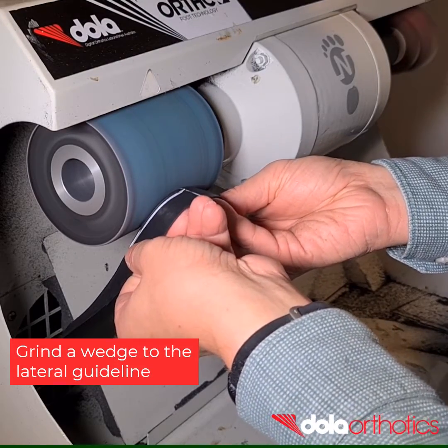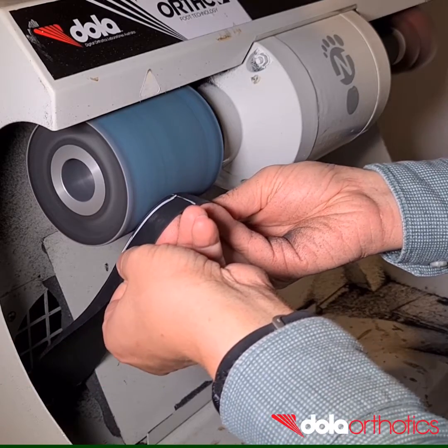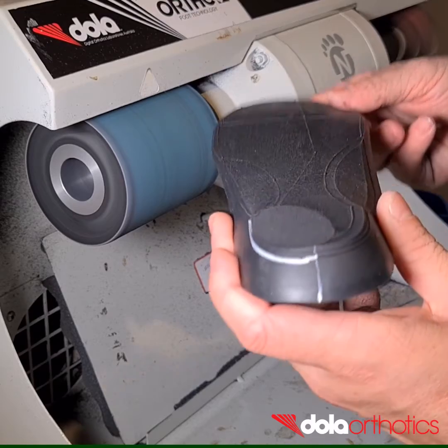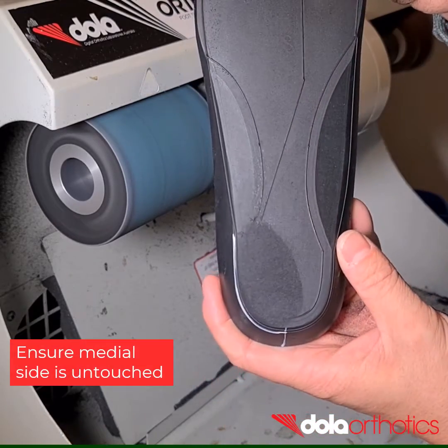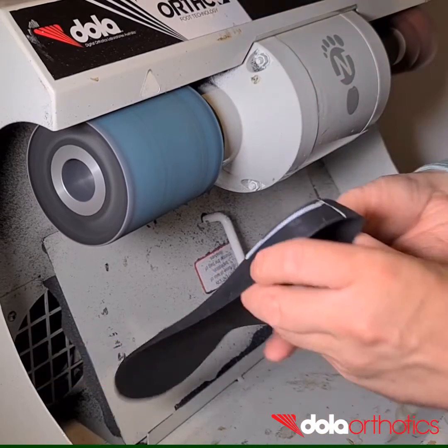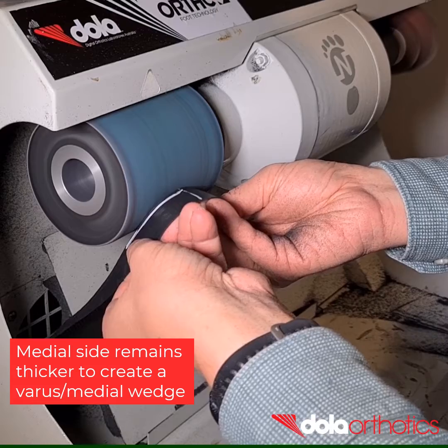Holding the medial and lateral sides of the orthotic shell, place the posterior plantar heel surface of the orthotic against the grinder. Hold the orthotic at an angle and remove material up to your lateral guideline. Ensure that this angle keeps the medial side untouched. The medial side will remain thicker than the lateral, creating a varus or medial wedge.